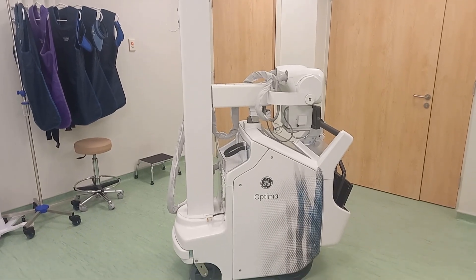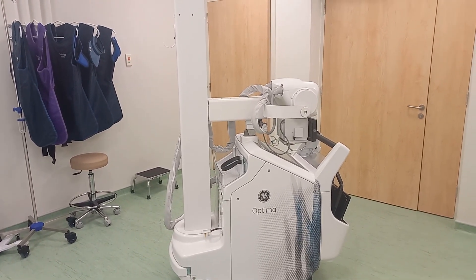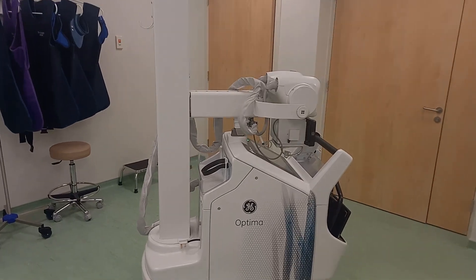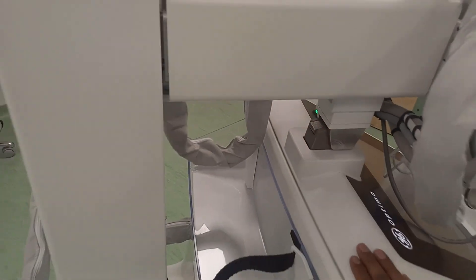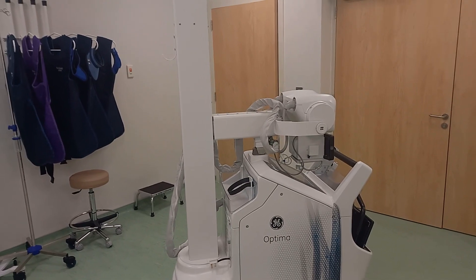We have the Optima 240 in front of us. This is the side view, and in this view if you focus on the tube arm, you can see that it is docked on the system. In this position you're going to get the maximum speed when you try to move the system.